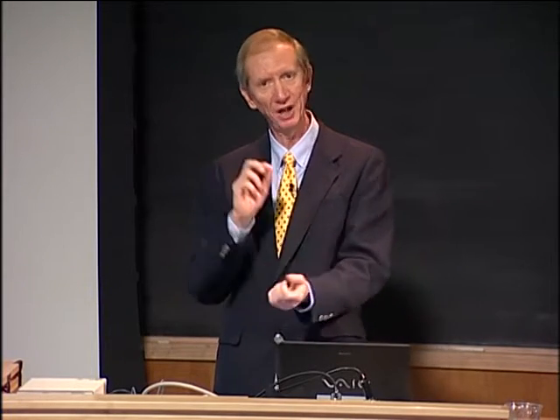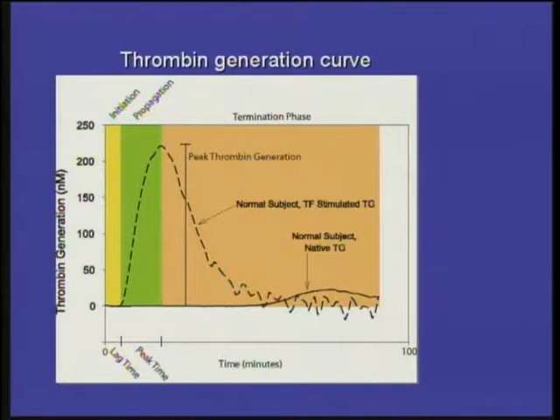The only thing I think the bleeding time is still useful for, if you wanted to do sort of theoretical studies, if you actually sample the blood coming out of a bleeding time wound, and you measure how much thrombin is in the blood over time, you get a curve that looks like this. It takes a few minutes for things to start up, and then once you start making thrombin, you fairly quickly will start plugging the wound up, and you'll get the platelets sticking to it. So you can get this kind of a curve sort of out of a bleeding time.